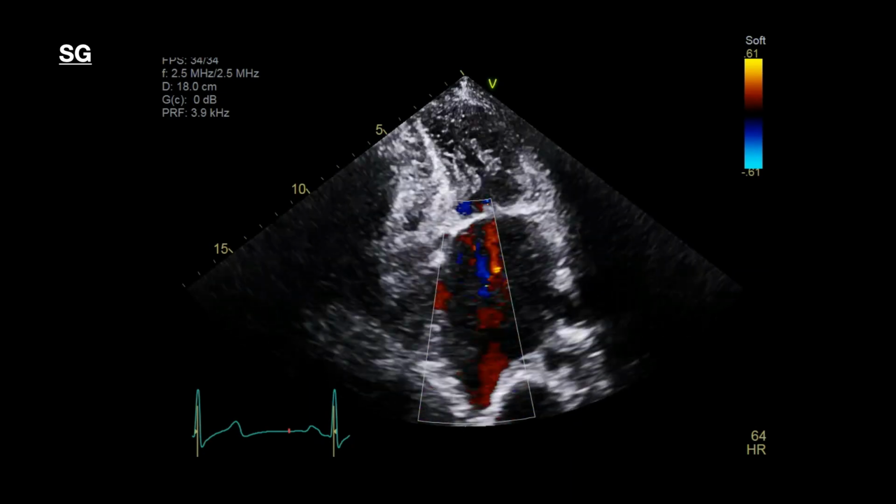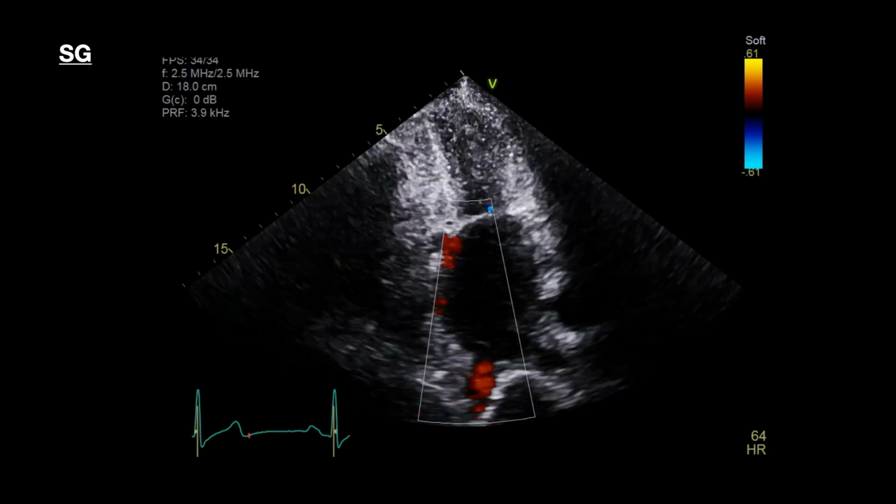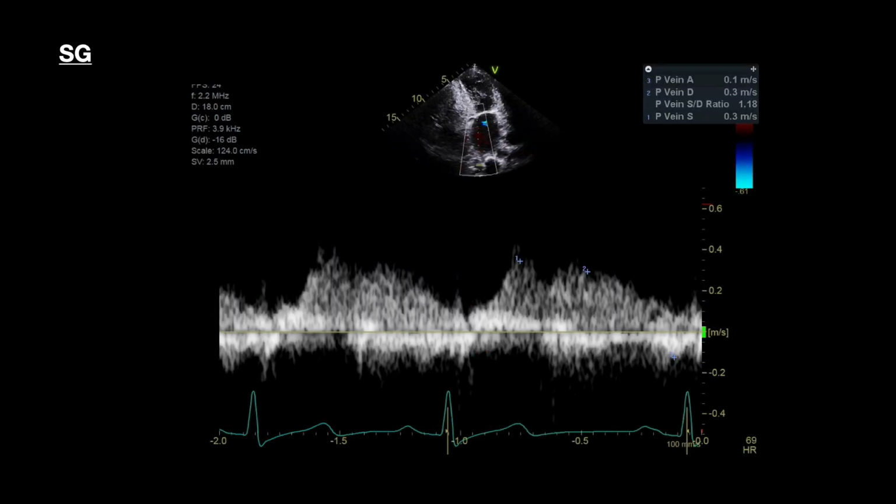So here they're looking at the pulmonary vein, which is right at the bottom of the screen, and interrogating pulmonary vein flows, which will help, in the setting that there's MR, to make an assessment about whether or not that MR is significant. And you can see here the S wave is bigger than the D wave. It's a bit hard to see, but it's labelled 1 and 2. So that's not consistent with severe MR.